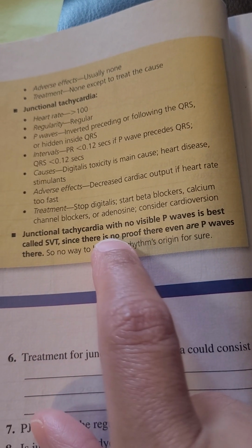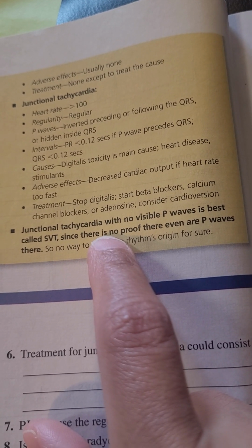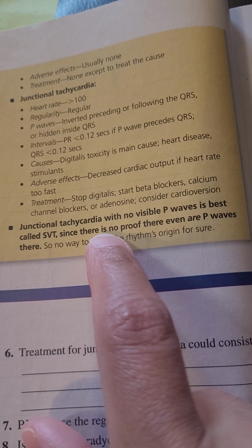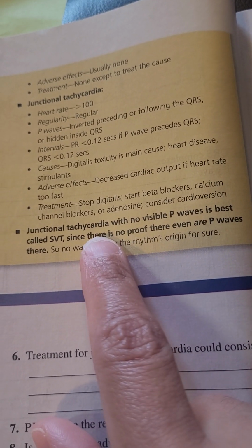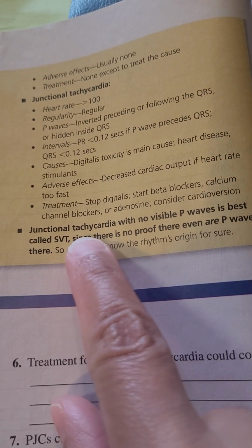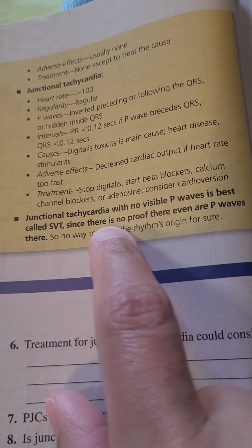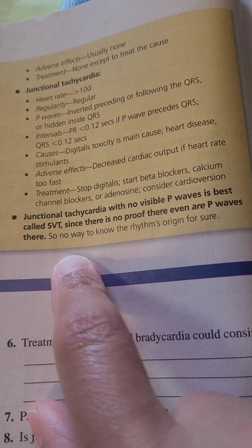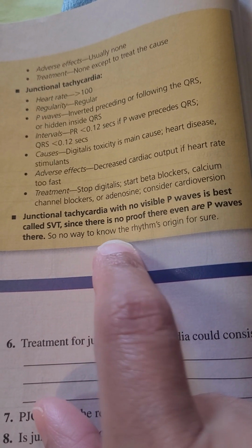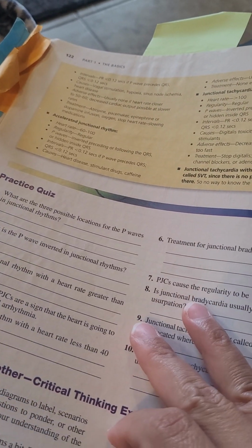If you see an inverted P wave in there, or you see one before or after the QRS somewhere, then most likely it's a junctional tachycardia, so inverted or too close to the QRS. But since there is no proof that there are even P waves there, just call it SVT. So there's no way to know the rhythm's origin for sure. If you see one of those rhythms, just call it an SVT.